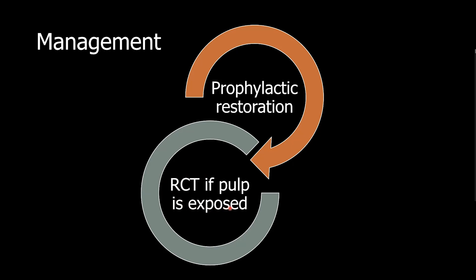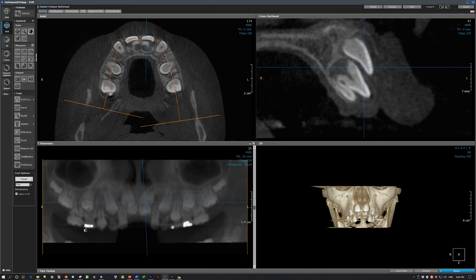Let me share with you a CBCT scan to show you the depth of the dens invaginatus. Here is a maxillary arch of a patient in mixed dentition. Let's review the number of the teeth: this is the canine, permanent lateral incisor, permanent central incisor. We also have a supernumerary tooth, another permanent central incisor, another supernumerary tooth, this is the lateral incisor, and that's the canine, followed by the other teeth of normal dentition.